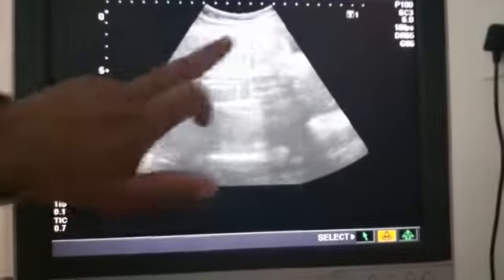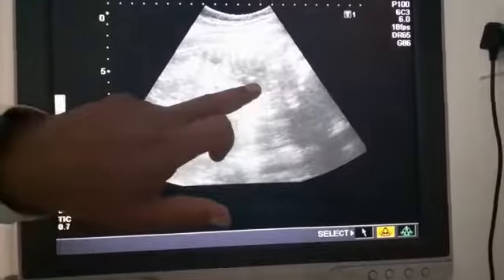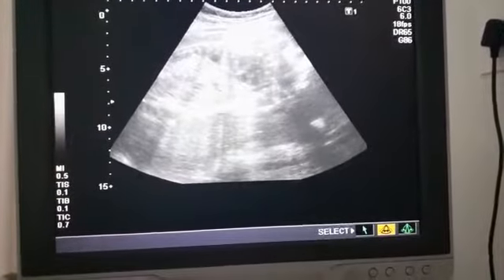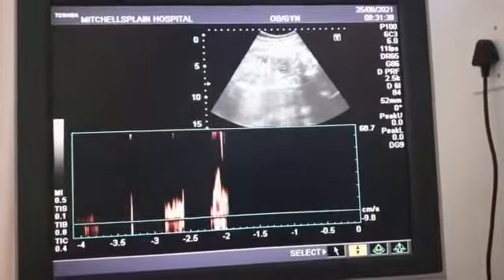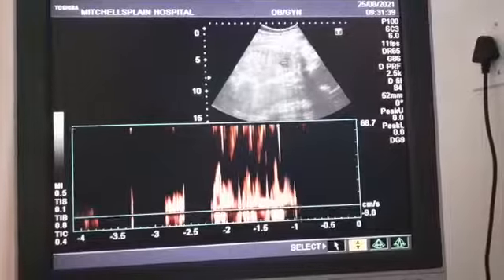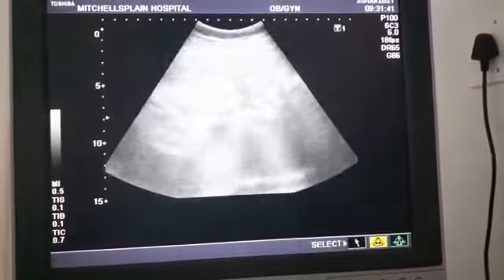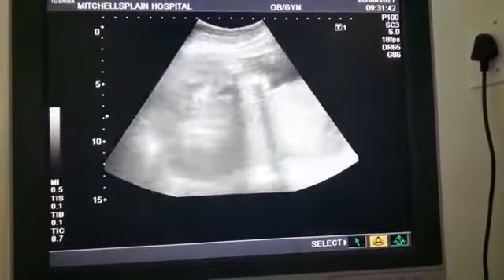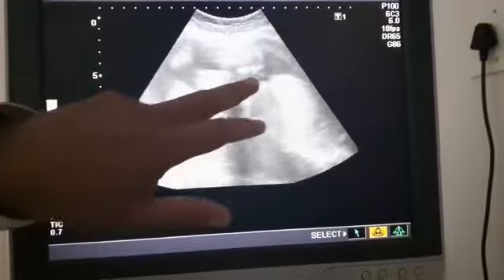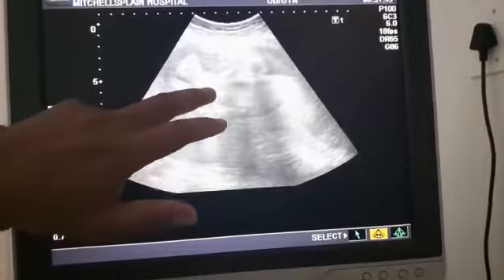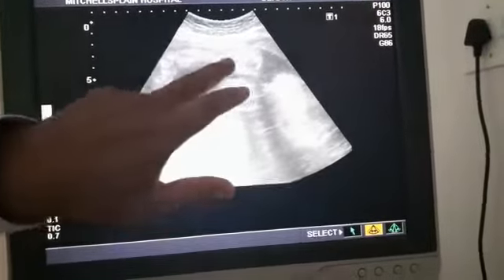Then this is the spine with the ribs, and there's a heartbeat — you can even listen to the heartbeat. And then here on top we've got the bladder, and you can see the legs are crossing over. There's one leg with the five toes.